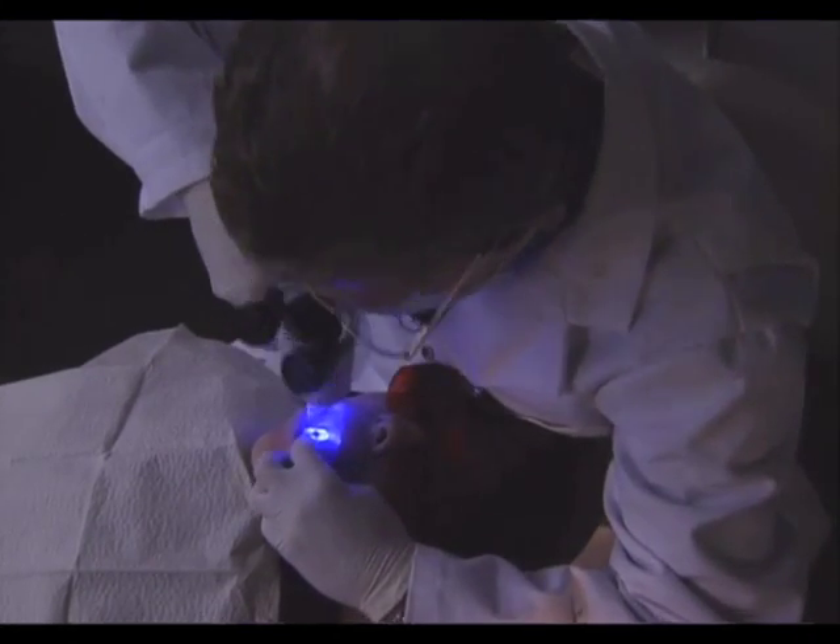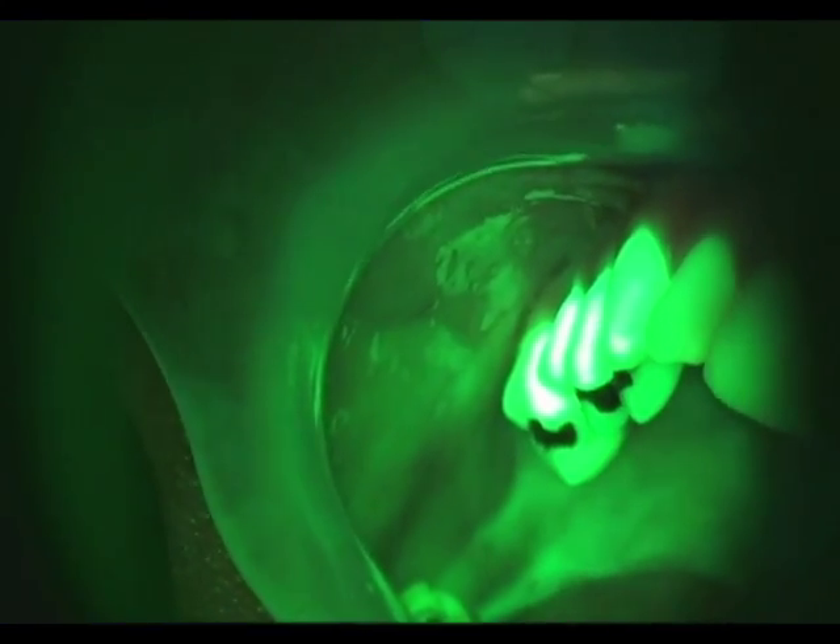By utilizing patented filtering in the handpiece, the clinician is able to directly view the different fluorescence responses to help differentiate between normal and abnormal tissue. Healthy tissue appears as an apple green color, while suspicious regions cause a loss of fluorescence and will appear dark.